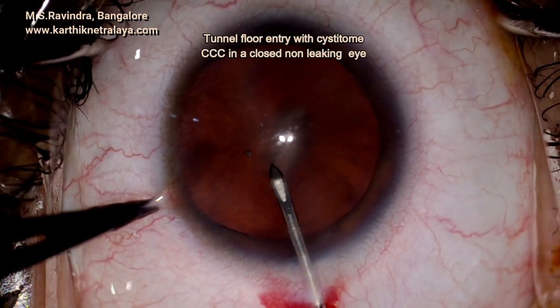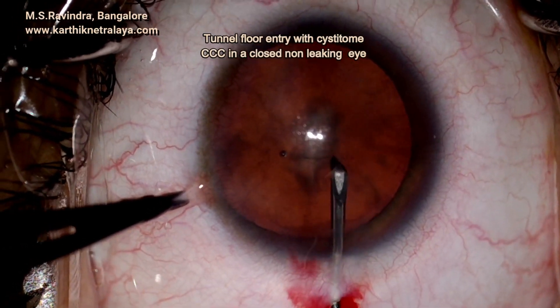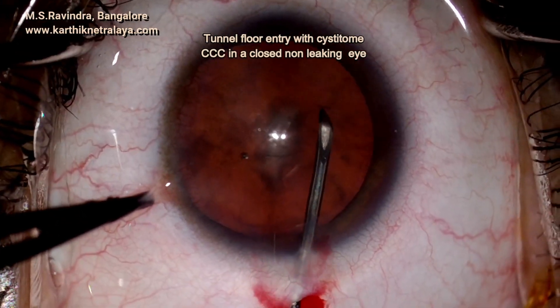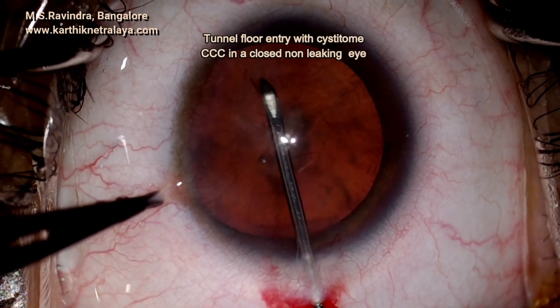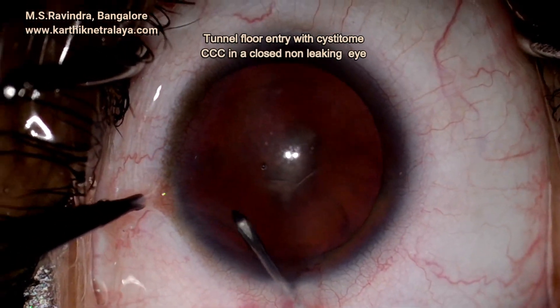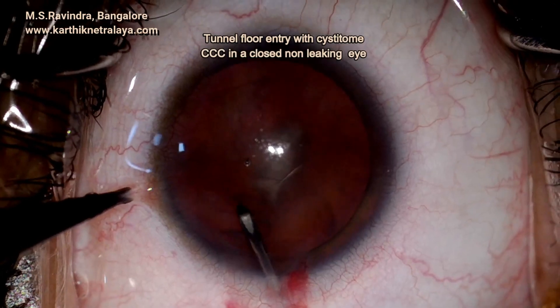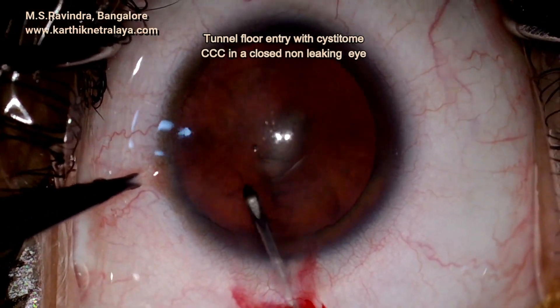Tunnel floor entry with cystitome seals the tunnel as you are doing the rhexis. The viscoelastic inside the anterior chamber is trapped and cannot leak out because the entry is at the floor of the tunnel at the anterior sclera. A good rhexis could be performed which is circular. The cornea is quite small so the rhexis appears larger, but it is of adequate size.